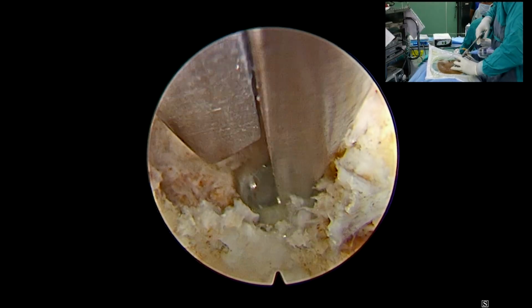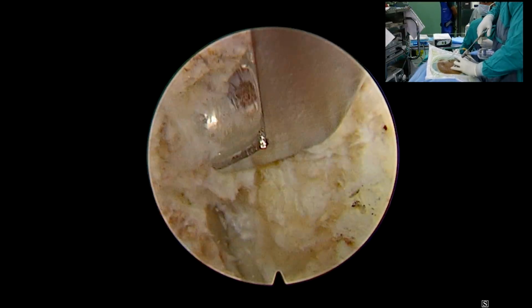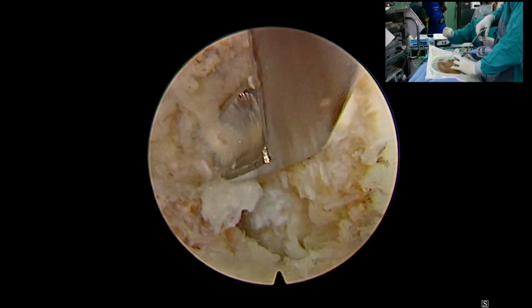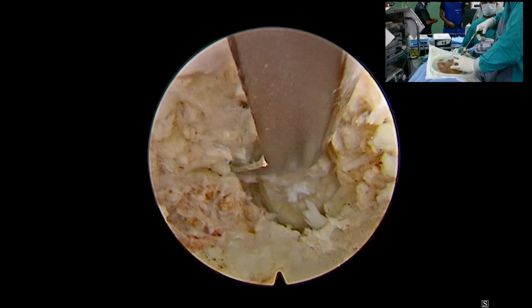We can check in X-ray where we are nibbling. Show the C-arm shoot, and after the shoot, take one in AP only. First AP and then lateral.